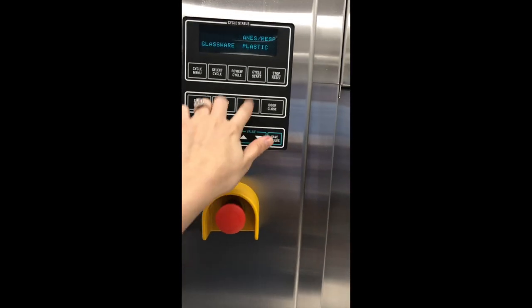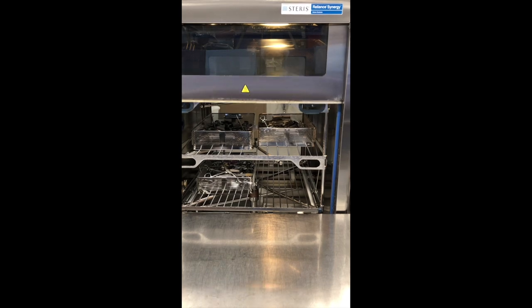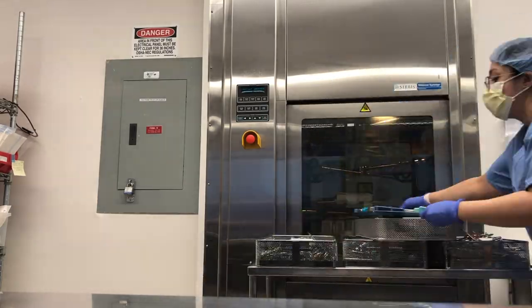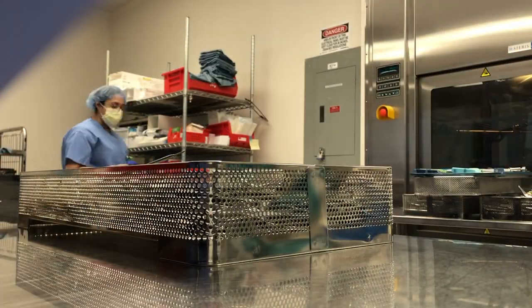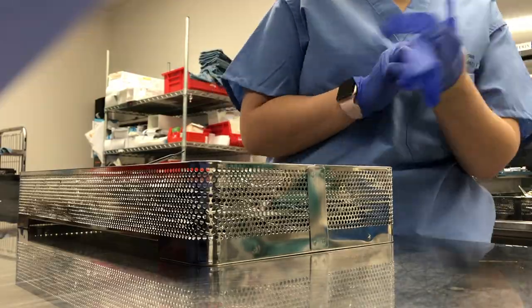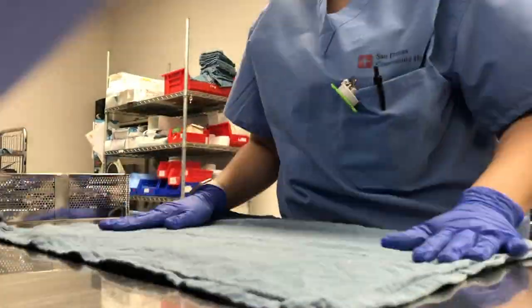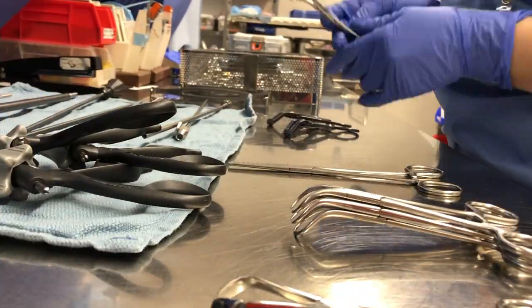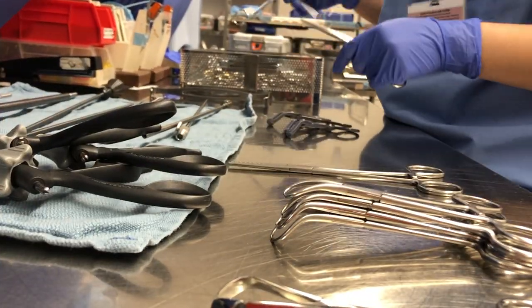Now to begin our day, I'm going to take out whatever was left in this washer from the night before and separate the instruments by which should be used first. As I'm taking them out, I'm seeing what instruments we're going to need for the morning — this is the first tray we're most likely going to need.